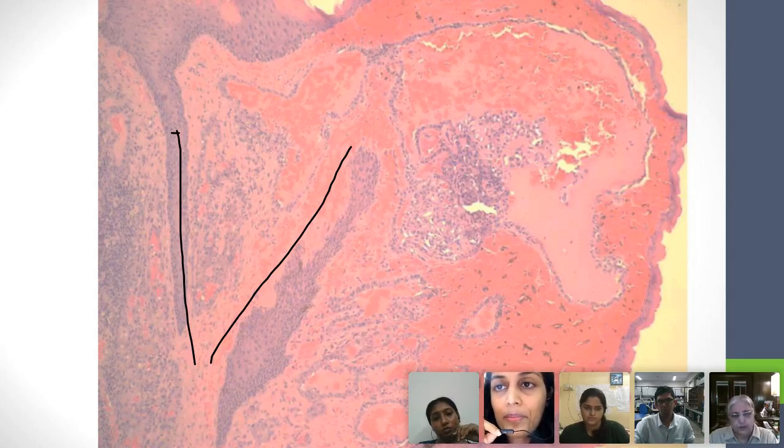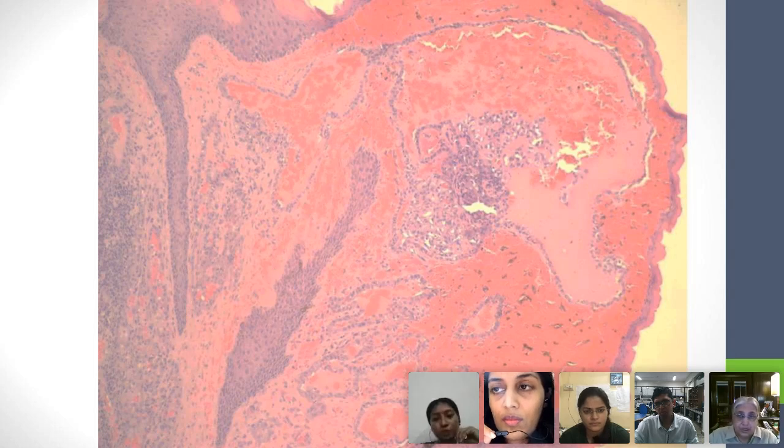No, ma'am. So everybody who thought that this is keratin, you need your eyes to be a little sharper. This could very well be part of this tumor, which is just some columnar epithelium over here. It could very well be that you can see a palisade actually all the way through. So please, this is not keratin. Have you understood that? It cannot be keratin. There is no way that it is, because you would have had to have so many layers or stratified layers below that. So this is not keratin.